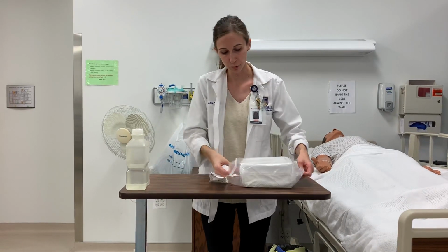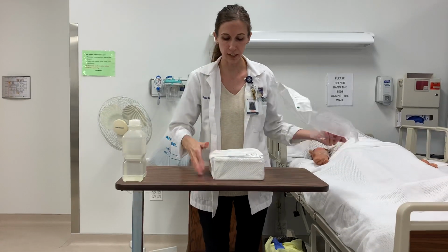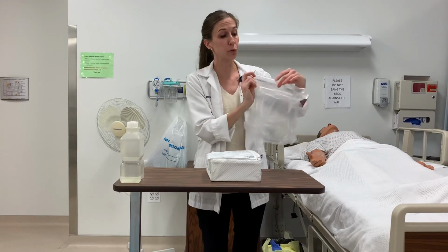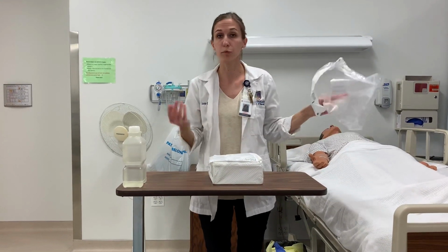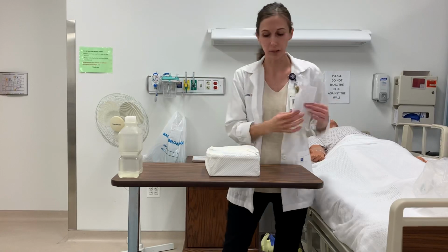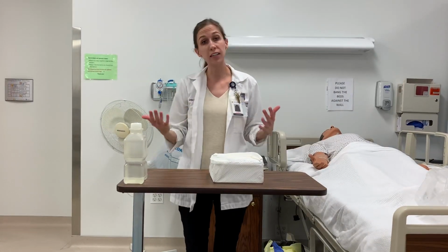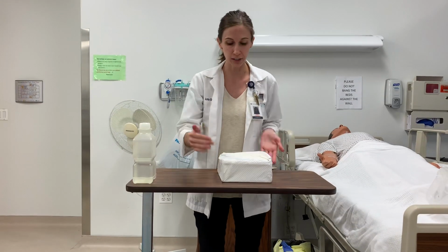Okay, and I can remove my sterile kit from inside. Again, it's on a clean surface. If I were to use this kit or this bag, I could even use this as a garbage, as we will when we're doing Foleys in the future. So I could put this on my patient's bed as I work with it. I can discard my label as well. And if you're not sure if you've touched anything and contaminated yourself, you can always do hand hygiene one more time before you open your kit here.